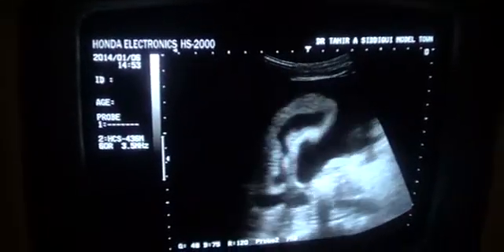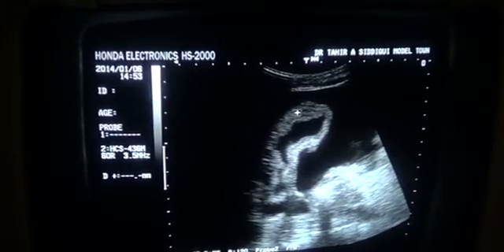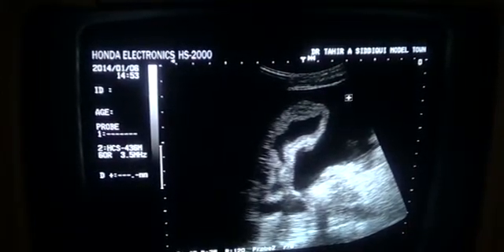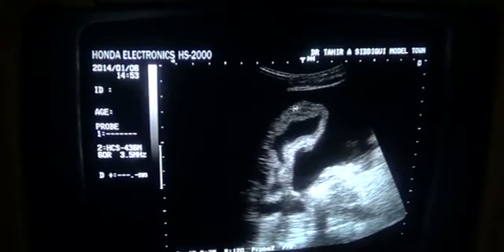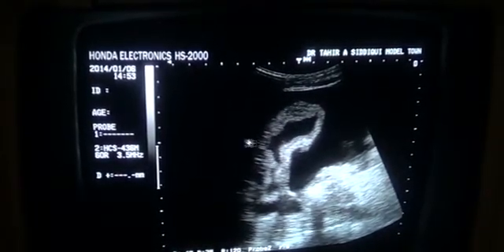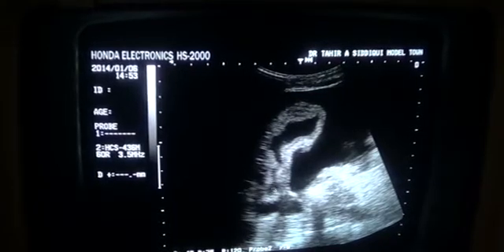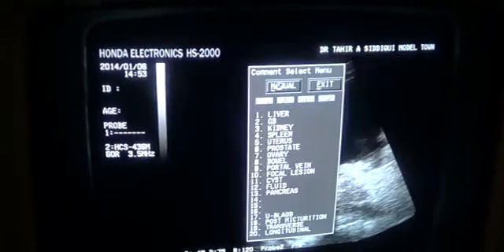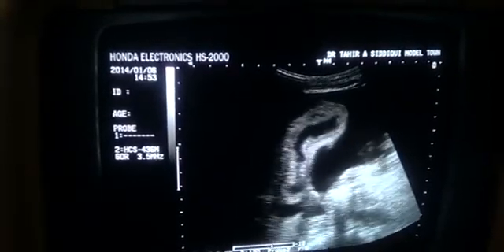You can see the gallbladder moving within the ascitic fluid. This is the gallbladder giving a striated wall appearance. This picture is seen in patients with ascites, in which the ascitic fluid surrounds the outer surface of the liver. This black area is all ascitic fluid, and this is the lumen of the gallbladder. This sac-like area is the gallbladder. No calculus or focal mass is seen relating to the gallbladder. Walls appear thick and striated, giving a striated appearance because of the significant amount of ascitic fluid surrounding it. The gallbladder is okay and clear.